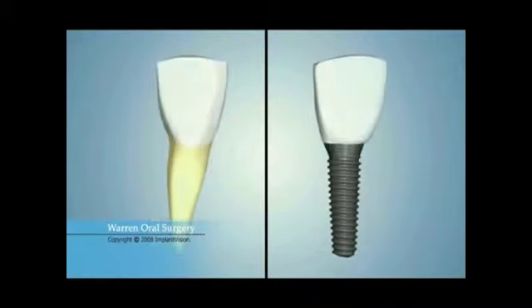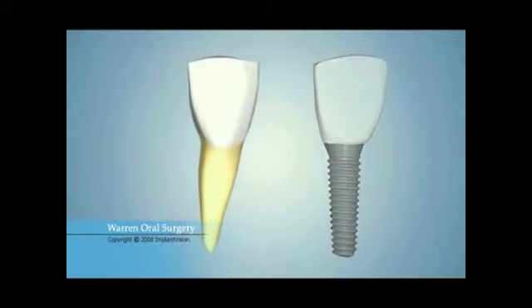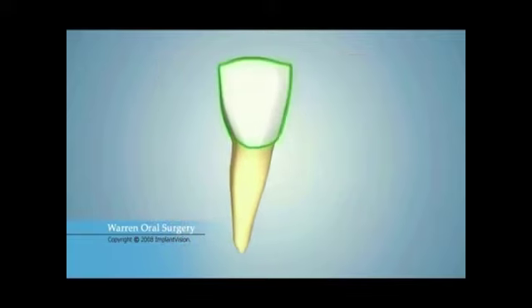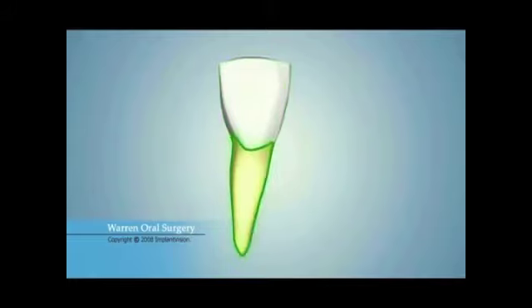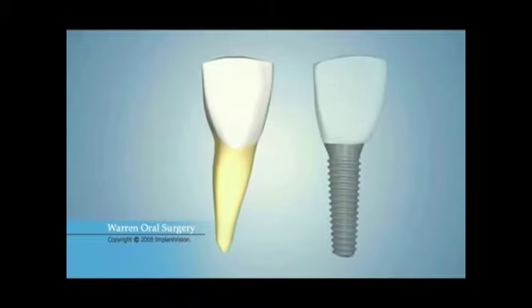A natural tooth is one piece, commonly described as having two main parts. One part is the crown that sits above the gums. The second part is a root that sits securely in your jawbone.